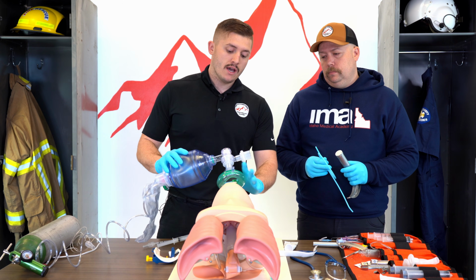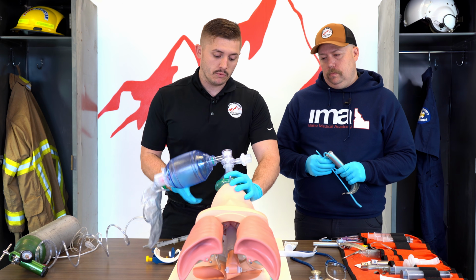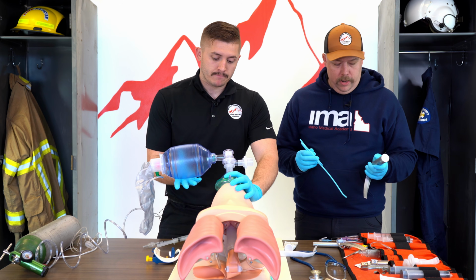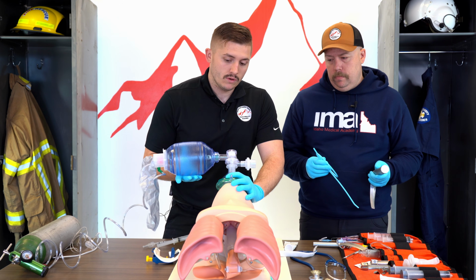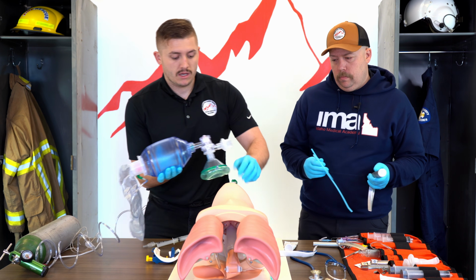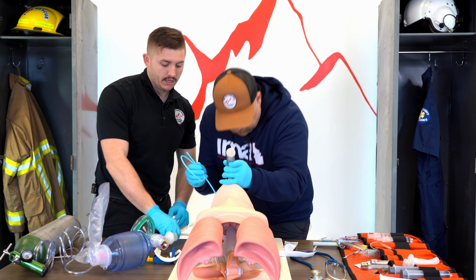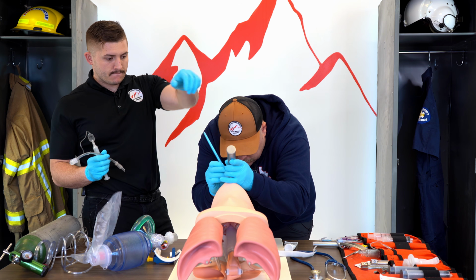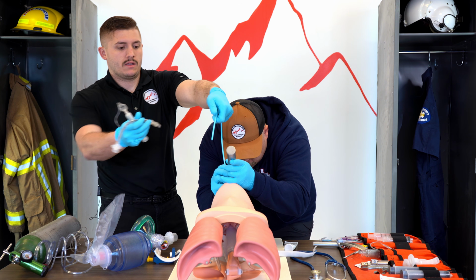He said, "Hey Cody, you're going to place this tube over the bougie once I get it set." I said, "Okay. Chris, you let me know when you want me to pull the OPA." "All right, next breath. 3, 2, 1." "Okay, OPA is pulled. Got this ready." "All right, so I'm going to stay here so I can continue to visualize. You go ahead and slide it over for me, please."